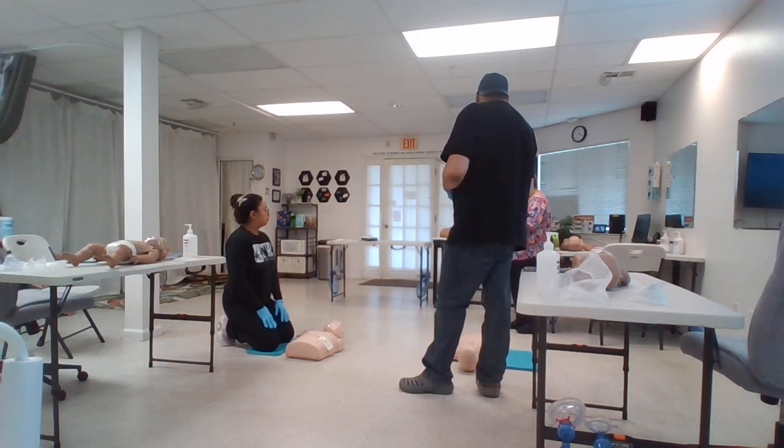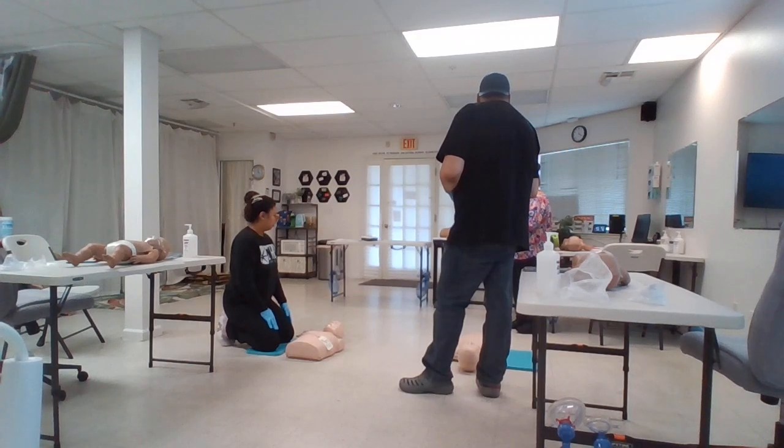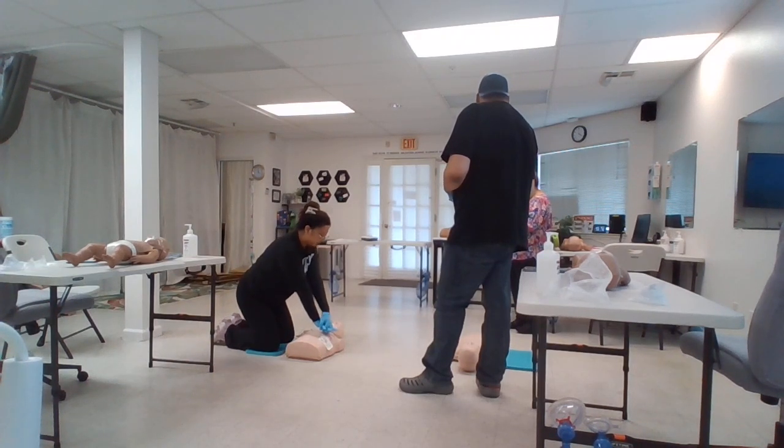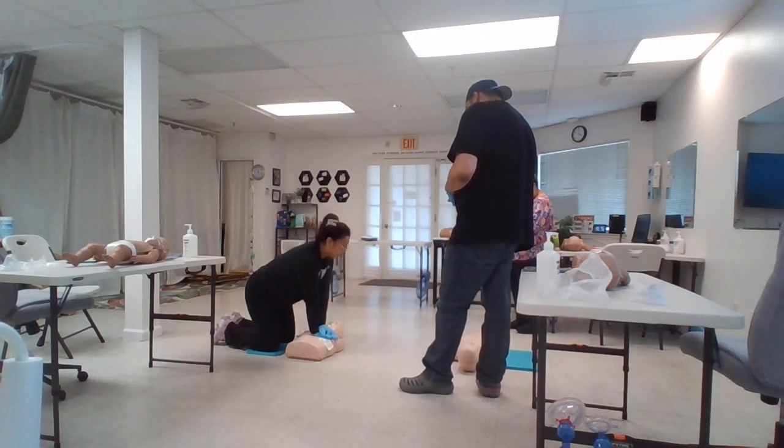Clear. Shock advised. Do not touch the patient. Everyone clear. Clear. Press the flashing shock button. Clear. Shock delivered. Begin CPR. 1, 2, 3, 4, 5, 6, 7, 8, 9, 10, stop now.